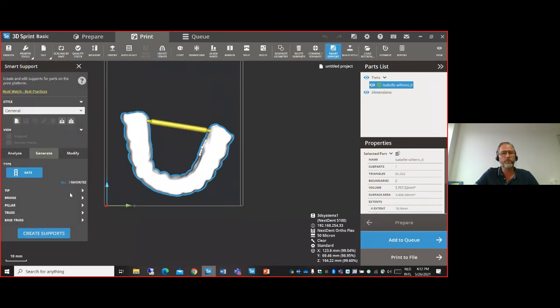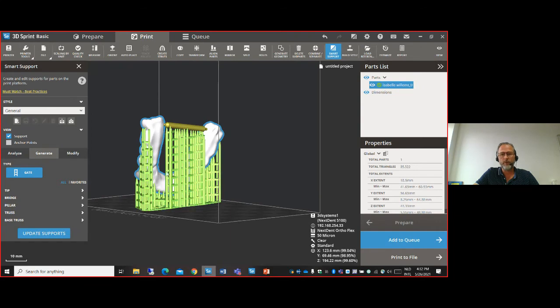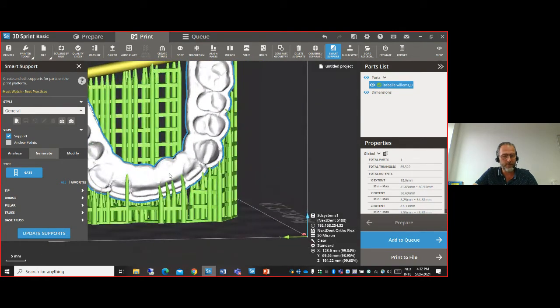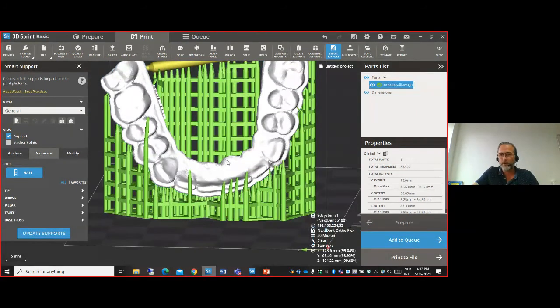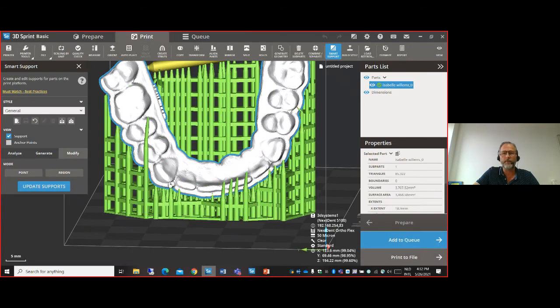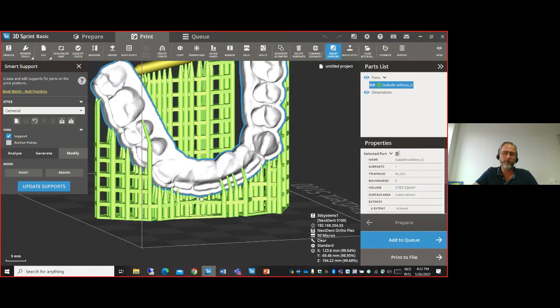After placing the support bar, use smart support to create the supports. The supports support the support bar and do not interfere with the occlusal side of the splint. Supports that appear inside can be dragged and dropped to a better position. After updating the supports, you can see these supports are no longer on the inside of the part. That's how easily you can orientate, support, and get the part ready for printing.